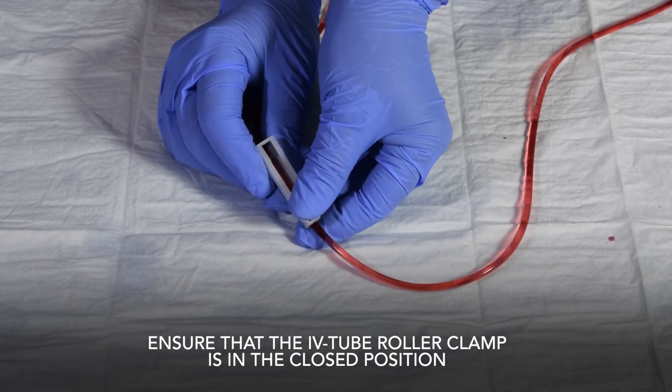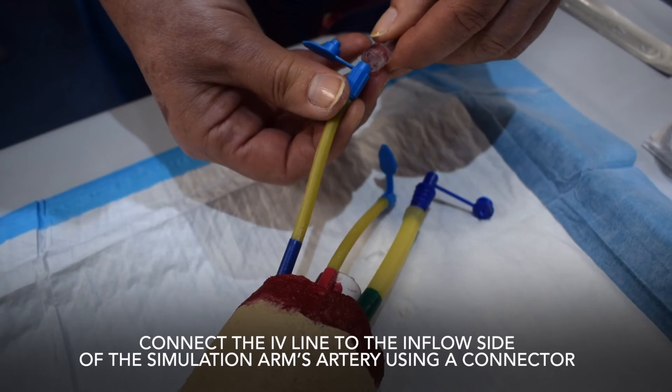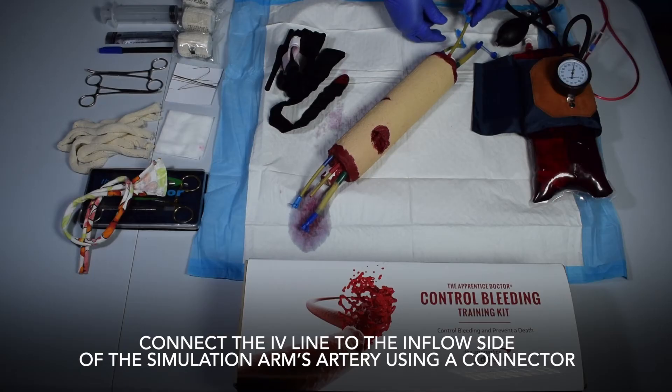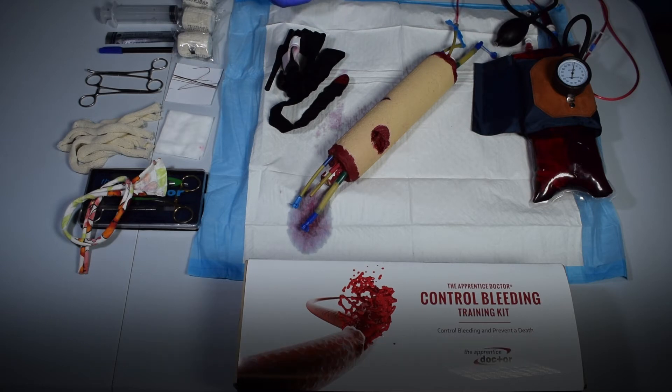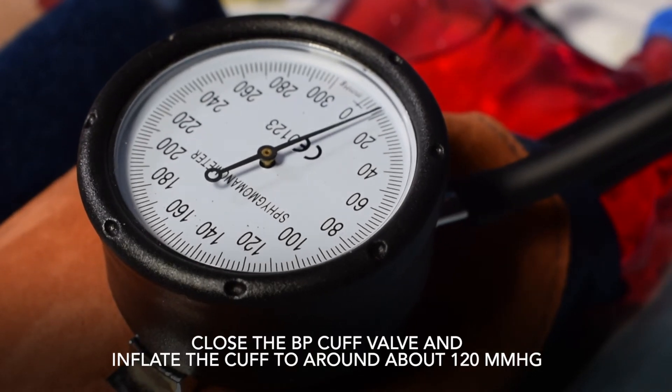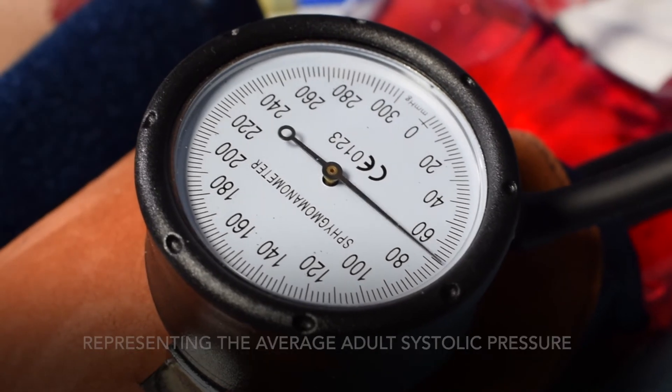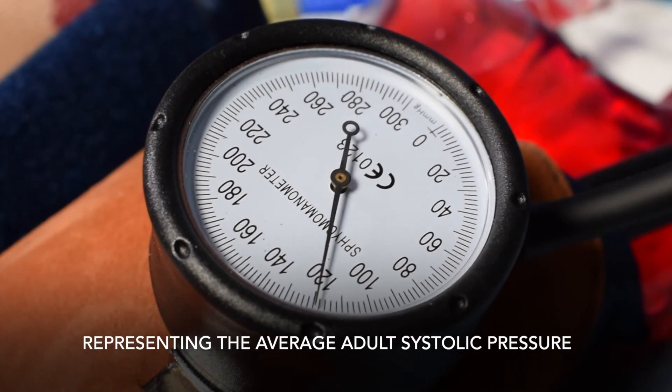Ensure that the IV tube roller clamp is in the closed position. Connect the IV line to the inflow side of the simulation arm's artery using a connector. Close the BP cuff valve and inflate the cuff to about 120 millimeters of mercury, representing the average adult systolic pressure.